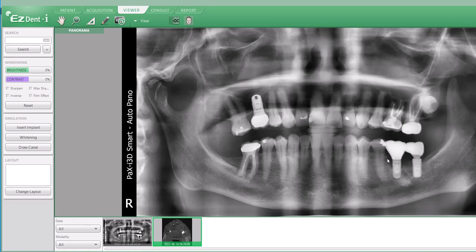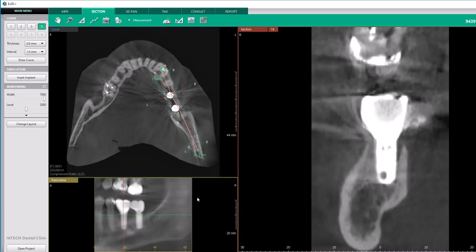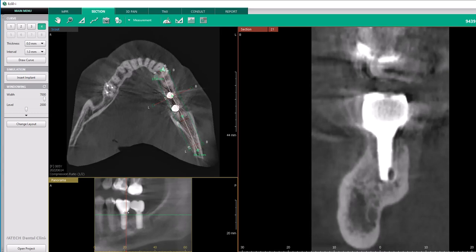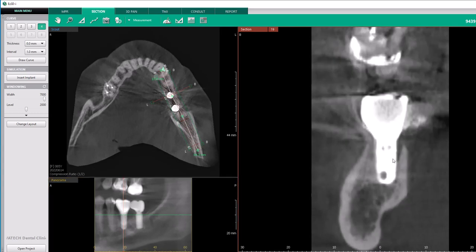Right off the bat, I asked her why she thought she might have an issue and she said she had some aching constantly in the lower left area. We took a panoramic x-ray and a 3D scan and right off the bat you could see some bone loss going around this dental implant. How we can tell is by looking for areas of decalcification. When bone is nice and dense, you can see how it looks. But when bone is being lost due to infection or just missing from bone loss over the years, it shows up as darkness. On the 3D scan in profile, you can see we are experiencing some bone loss around this dental implant.